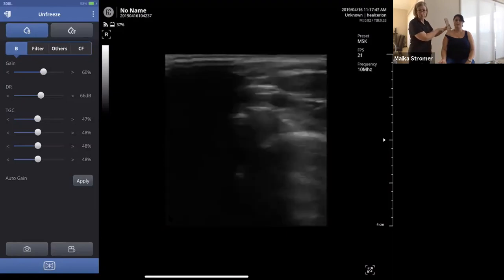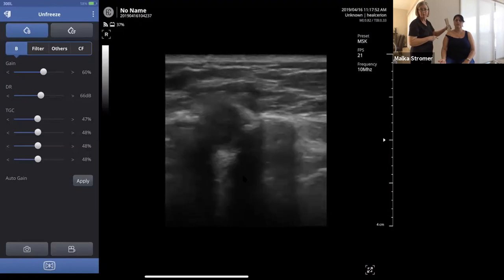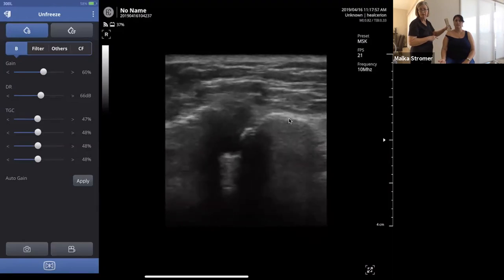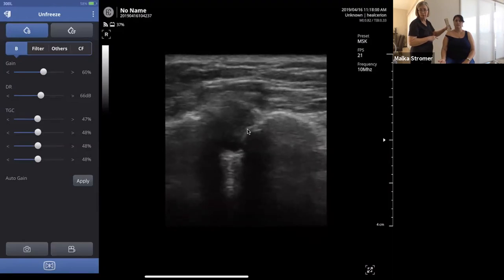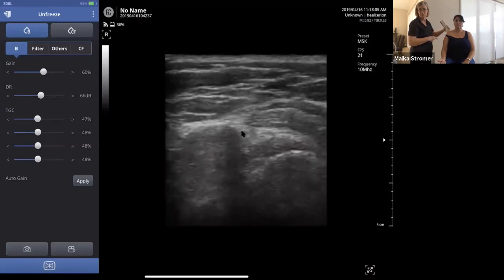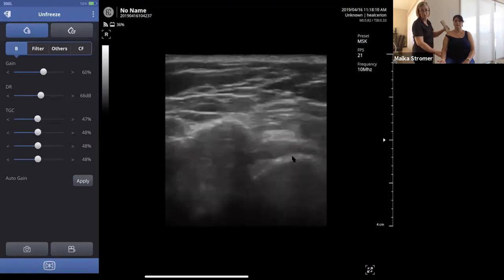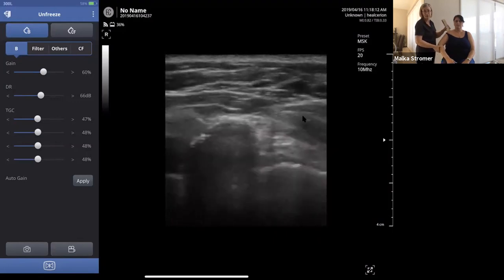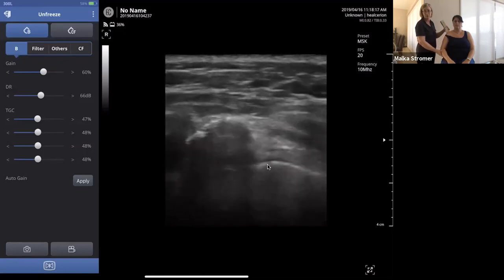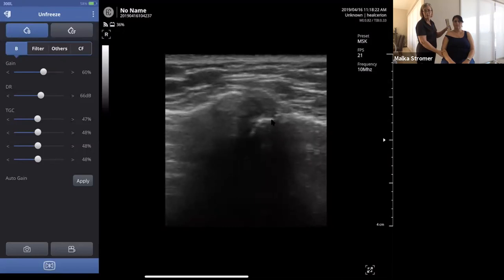I'm going to go across the bones to see both bones here. We have clavicle to the left, acromion to the right. She does have a little bit of spurring down in there. You can follow this lateral over with the acromion and then the humeral head to the right. The supraspinatus is above that, and I'm going to just abduct her, looking for impingement, but this moves pretty good. And then back to the AC joint.